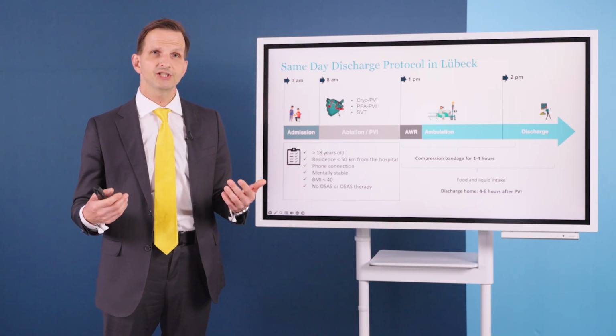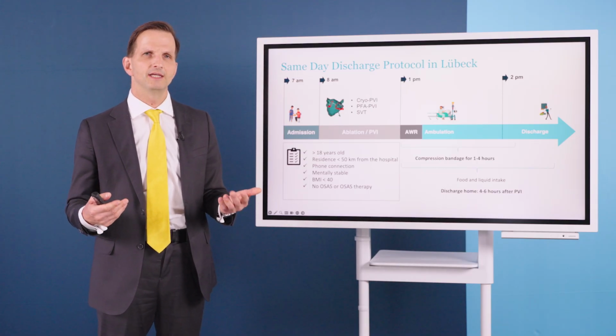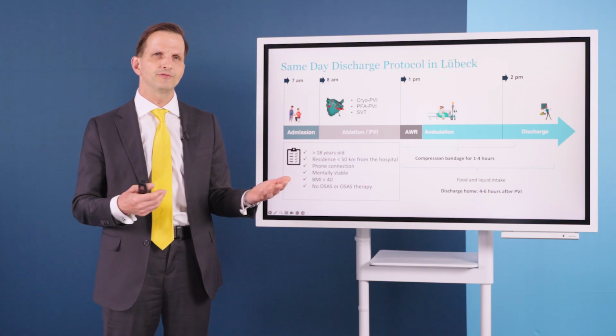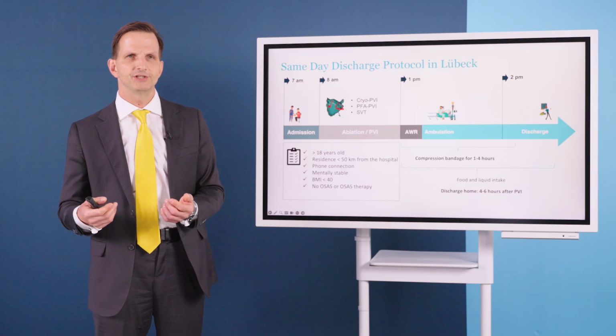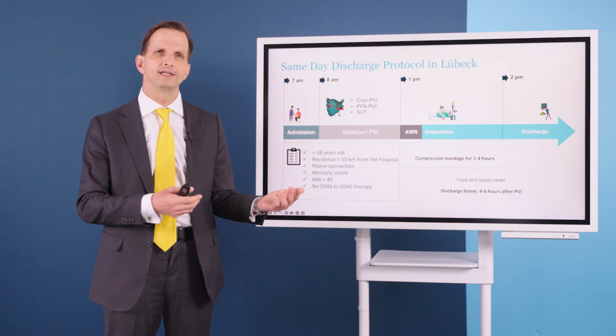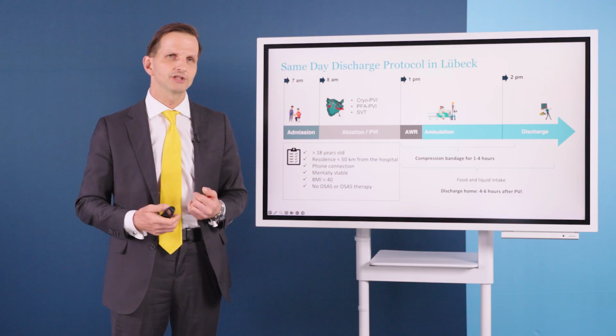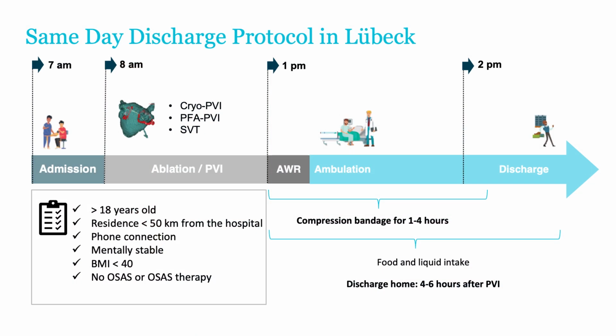An important consideration and decision that you have to take is whether it's an inpatient procedure or an outpatient procedure. We do perform PFA procedures on an inpatient basis and on an outpatient basis. But if you do same-day discharge procedures, you need a standardized workflow. So for us these are the early morning procedures until 1 o'clock in the afternoon.